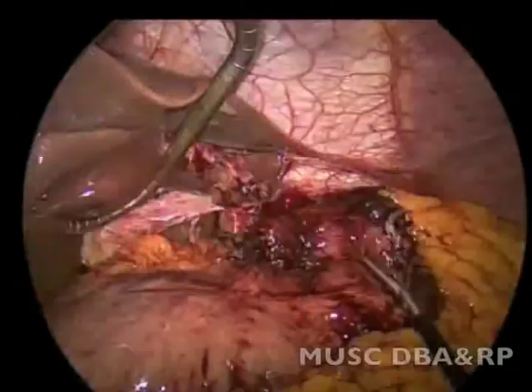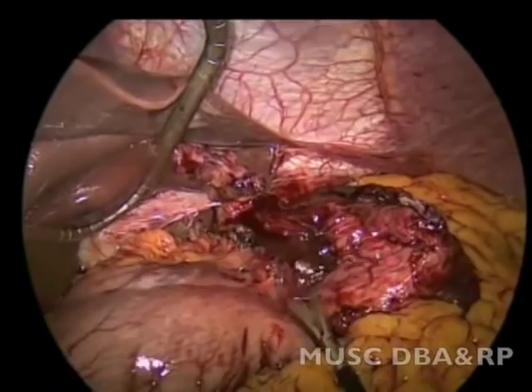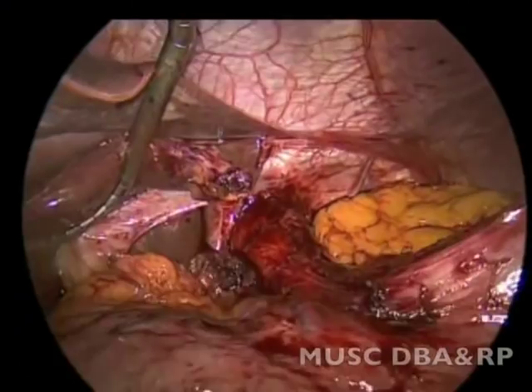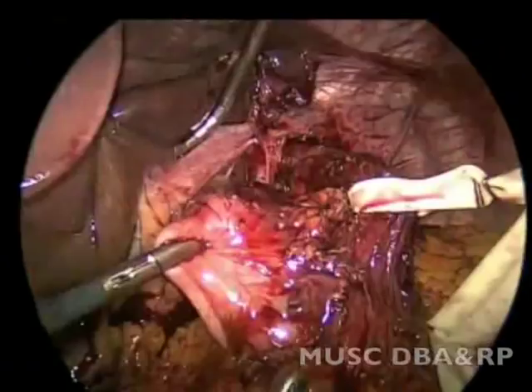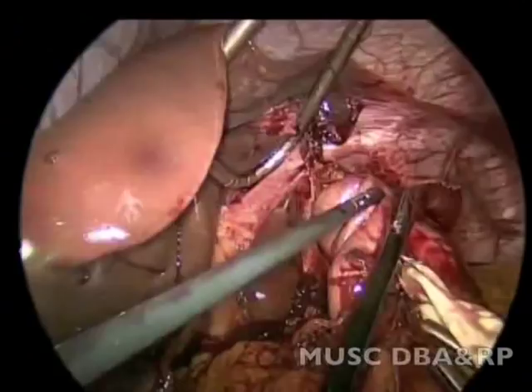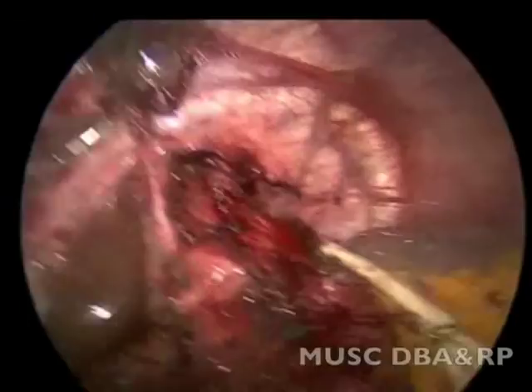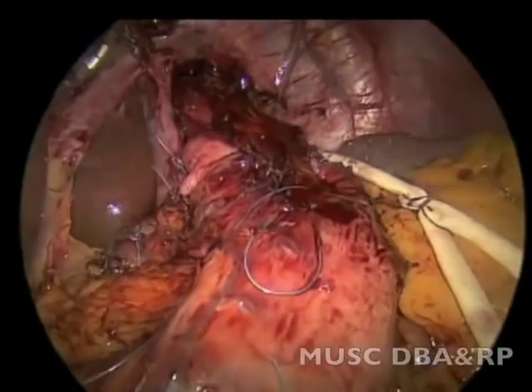A 58 French bougie is placed, which passes in and fills up the gastroesophageal junction, showing that crural patency is adequate. The wrap was then reconstructed in a Toupet fashion due to the patient's dysphagia. The patient recovered well, swallow study was negative, the patient's dysphagia resolved with resolution of reflux, and the patient has gained adequate weight.